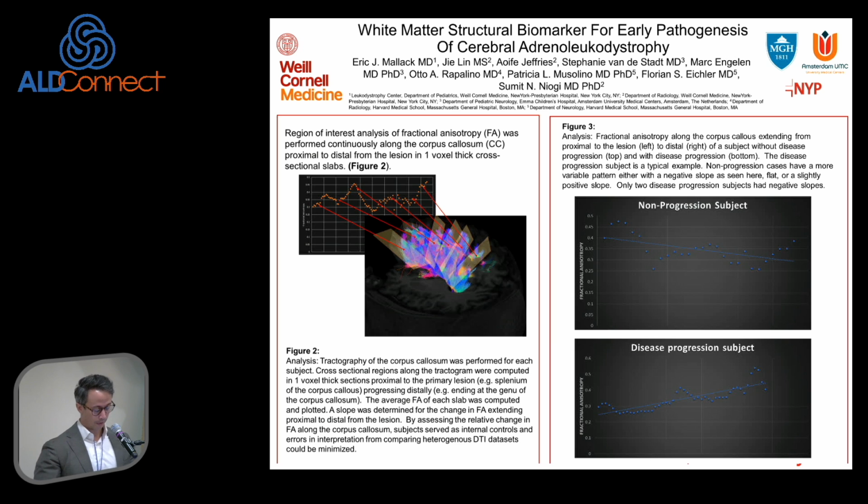So what we did is we looked at a data set of patients with progressive disease and then patients with inactive disease, defined by, well, one, their clinical outcomes, but also whether or not they had lesional enhancement versus no lesional enhancement. And if you can imagine, we all talk about the corpus callosum, the splenium of the corpus callosum. What that really is, is a bridge of connecting fibers between both halves of the brain. In the patients for whom we have data, we know that most often the lesion starts in the back of that bridge. Sometimes it starts in the front. But we lined everybody up and we said, here's the bridge for this patient, here's the bridge for this patient, and we lined up all of their lesions.